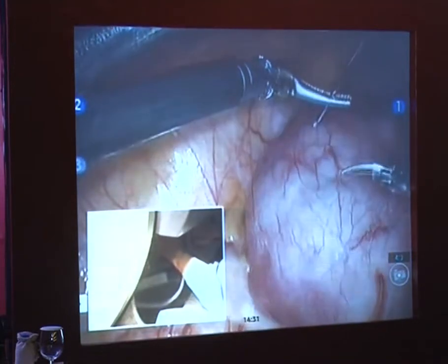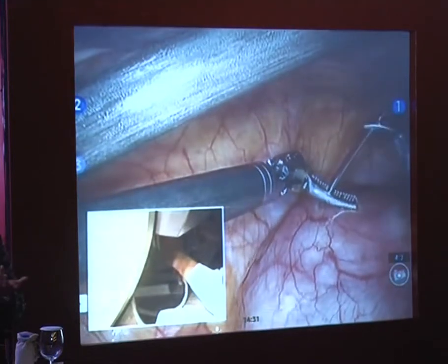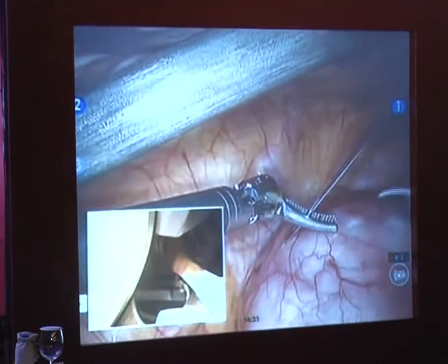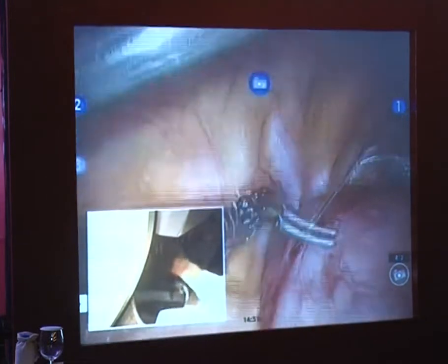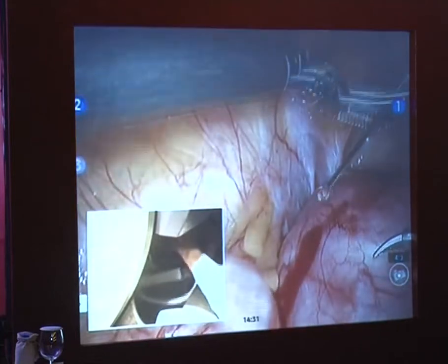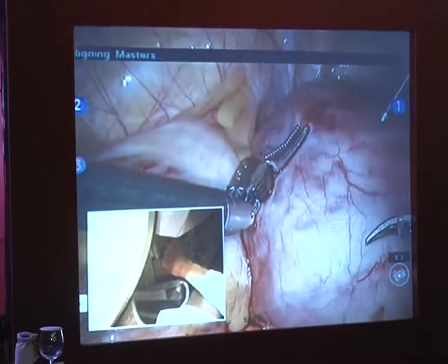Can you guys turn on the PK? The PK hook is not running right now, so I need the PK, please. I have no juice. Is it plugged in? I plugged it in, I believe. I think it's malfunctioned again, because when we had the power outage, I think it may have shut the PK off. Can you guys turn on and off the gyrus? Yeah, I have no juice. You can go ahead and take the needle out. I think we've got enough vasopressin in here. Is it booting up?